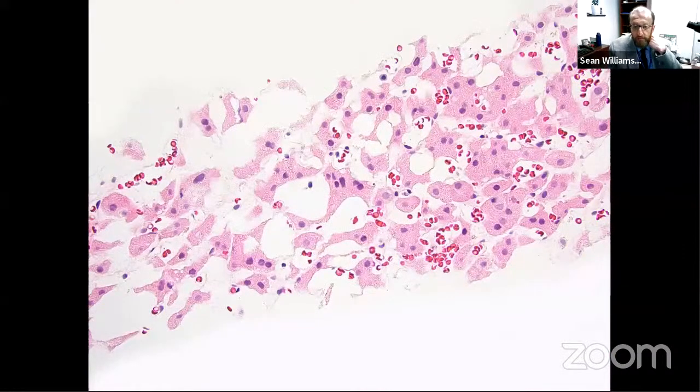Something that I find to be very helpful in recognizing these is that there are frequently edematous areas within the tumor where the cells seem like they're stretched out and just barely loosely connecting with one another. To me, they sometimes almost look triangular in shape, reminiscent of the way that, say, cardiac myocytes are loosely connected to each other at the ends of the cells.